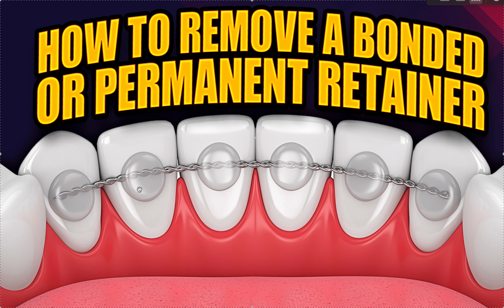There are bonded retainers that are made with a braided wire and 6 little blobs of glue. There are ones that are just a stainless steel bar with a mesh pad on just 2 teeth. Those are a lot easier to take off. For the most part, if the patient is young, has long roots, and the perio is stable, I can usually just pop it off with an adhesive remover with a claw.